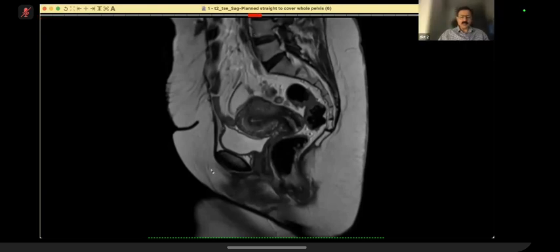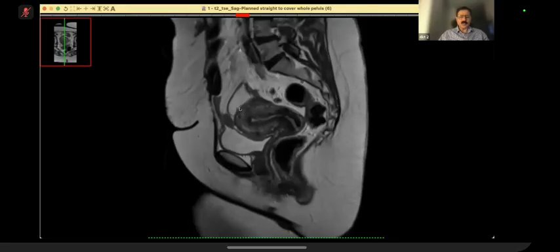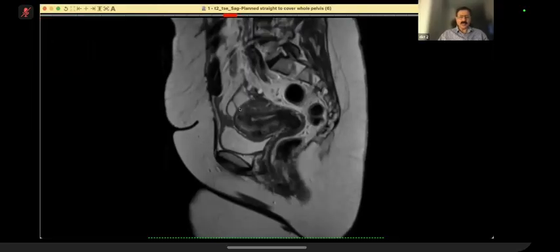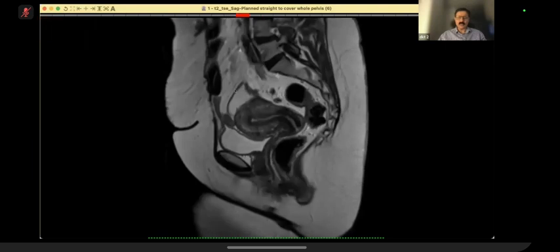So, very interesting that your diagnosis is correct, but your findings are incorrect. So, let me go through it. Do you do MR pelvis? Sorry, gynae pelvis? In your practice? No. Madam? No, I don't. Okay, here you are. So let's go through the basics.